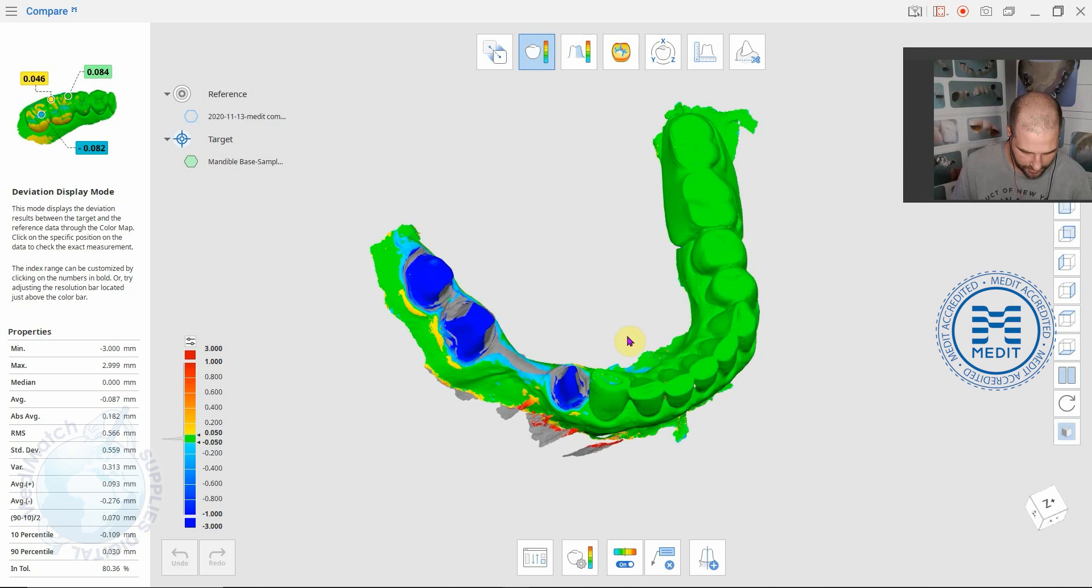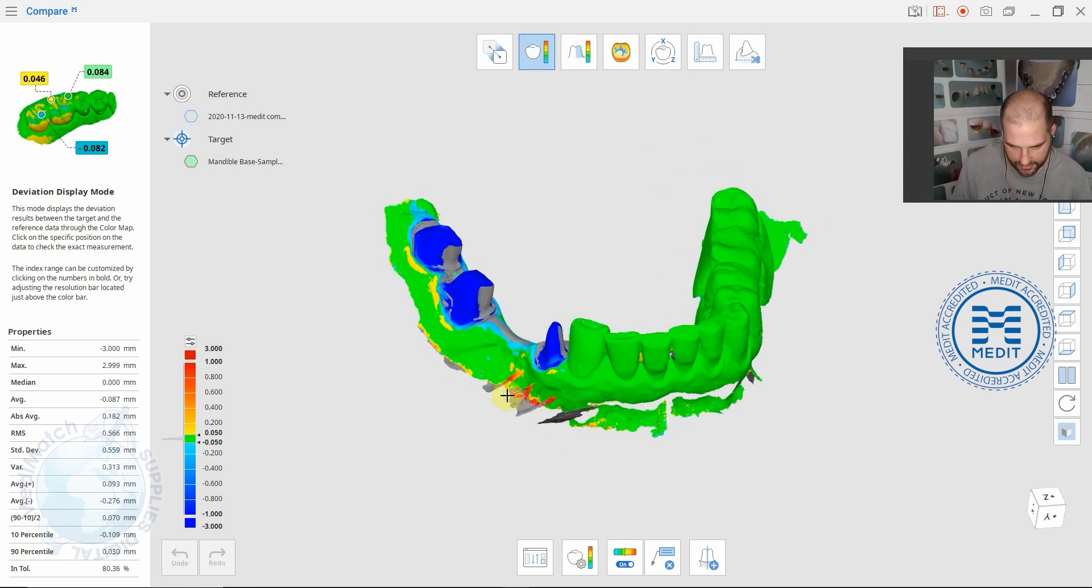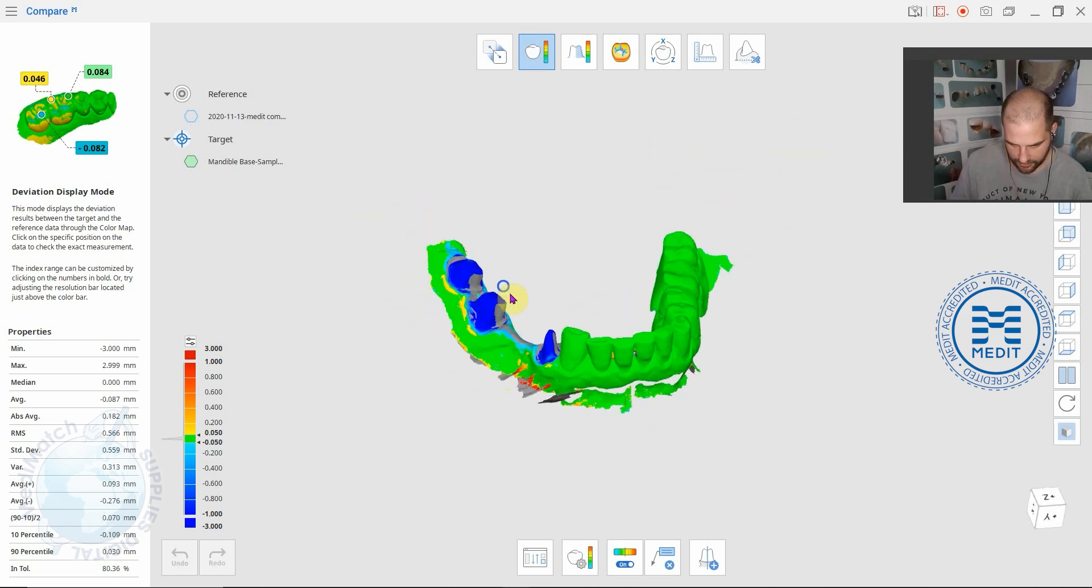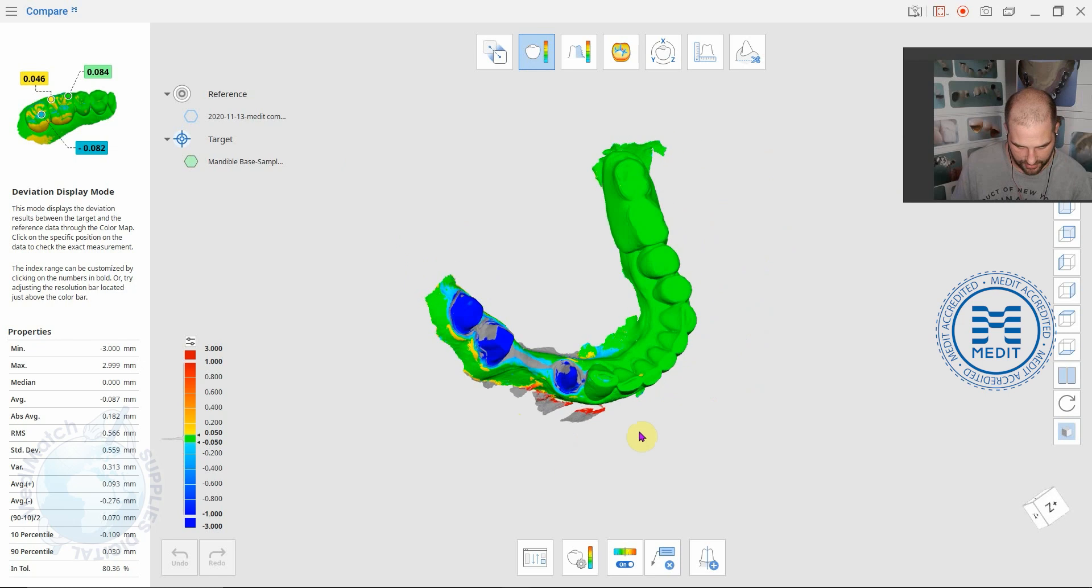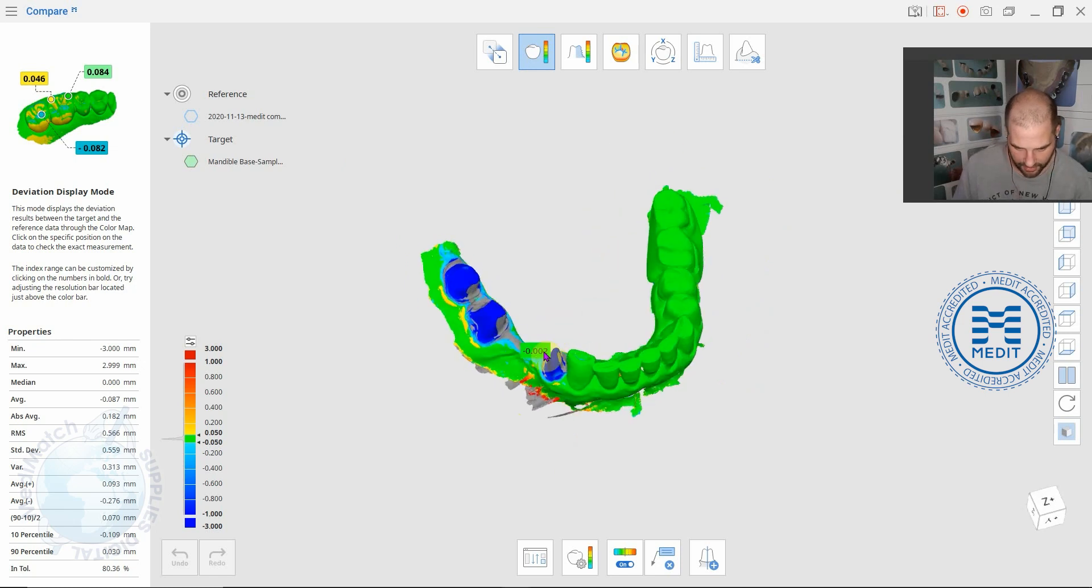Where there's any red, this is unreliable data. That will just be where there's extra data where the scans haven't quite lined up.